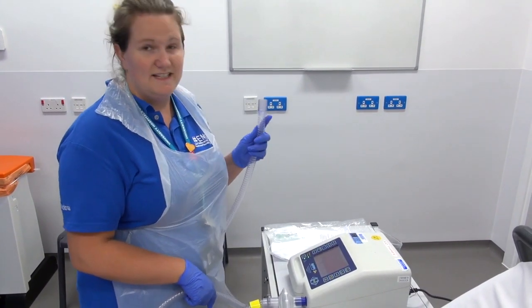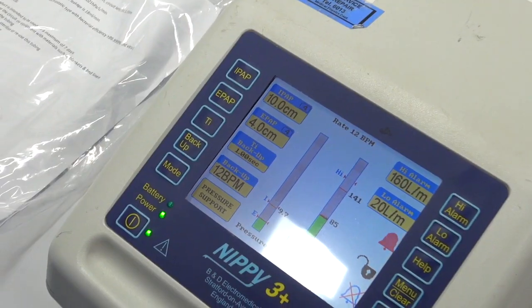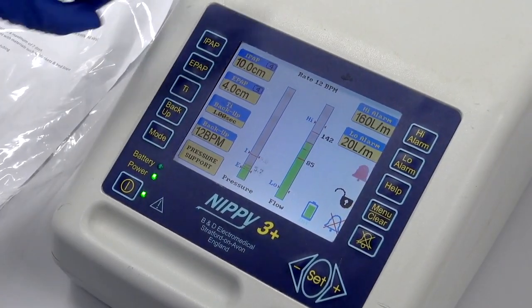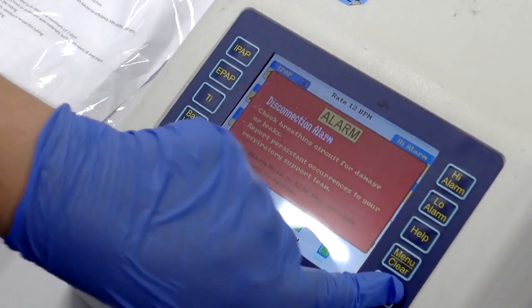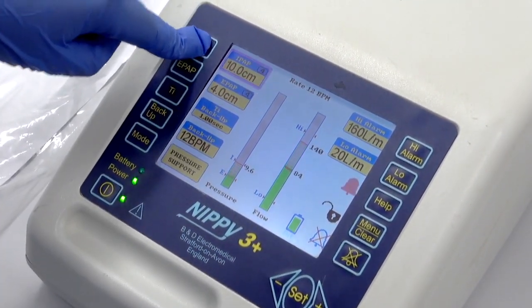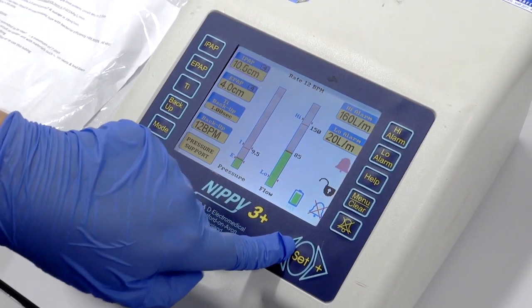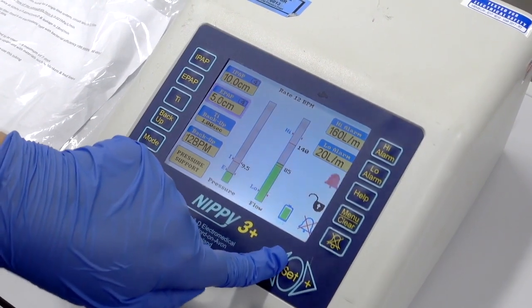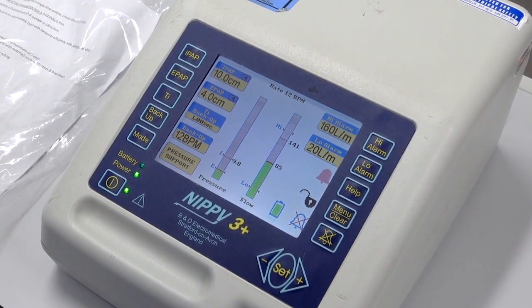To test the disconnection alarm, leave it off the patient — when it alarms you know it's working. You can then cancel the alarm and attach the mask to the patient. If the settings of the IPAP and EPAP are incorrect when you get the NIV machine out and switch it on, make sure that the machine is unlocked, select the value you want to change, and use the plus and minus buttons to adjust the settings. When it's 10 over 4, press set and that's what will be delivered to the patient.